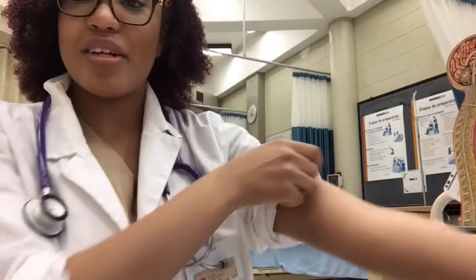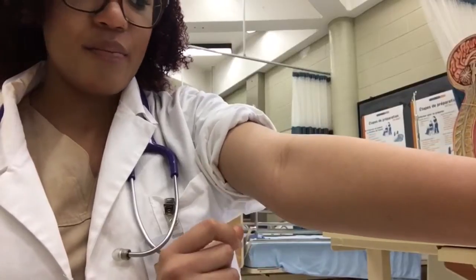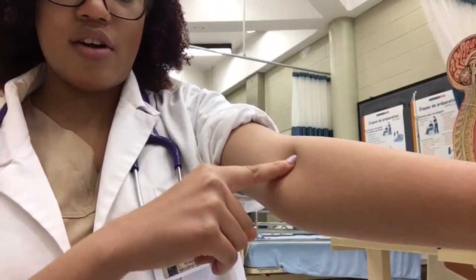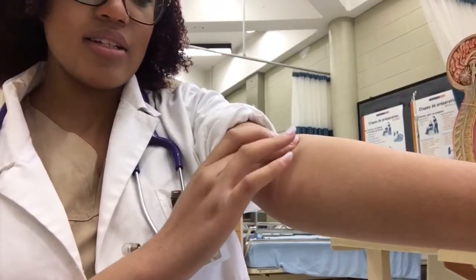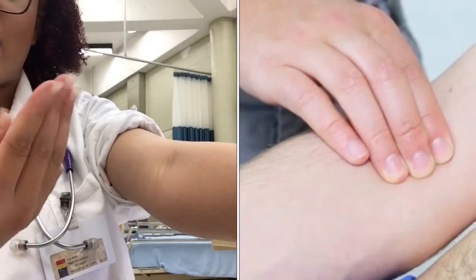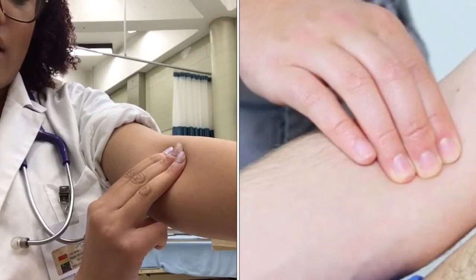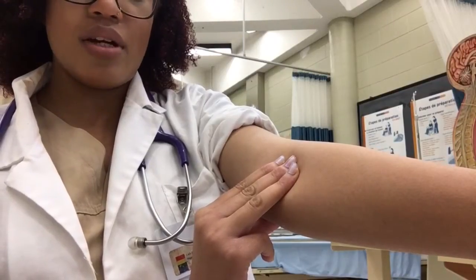So what you're going to do is get your patient's arm. I would have gotten a fake patient like one of my classmates, but they're on break. You're going to take the person's arm and come up to the center of the arm right here. You're going to feel a little dent in the middle of your brachial area. Right next to that dent, you're going to feel a little bone on both sides. I always use three fingers to look for a beat — some people use two, but I find it easier with three. Put your three fingers in the middle of your arm and slide over a little bit towards where the bone is, and you should feel a heartbeat. Once you've found that heartbeat, that is where you're going to put your stethoscope.